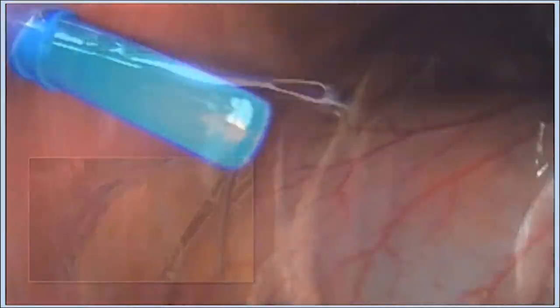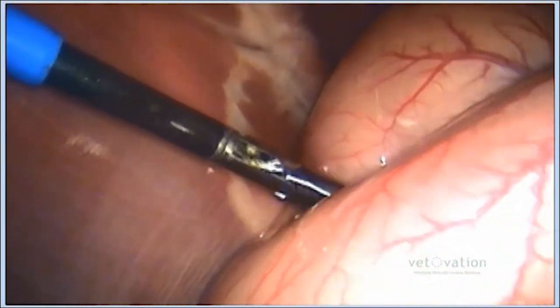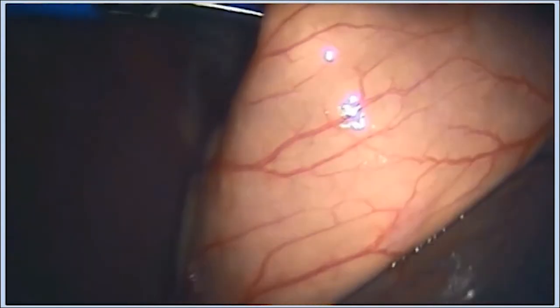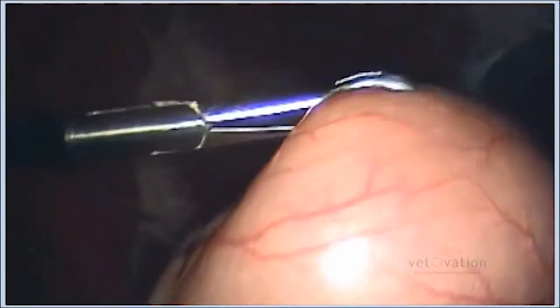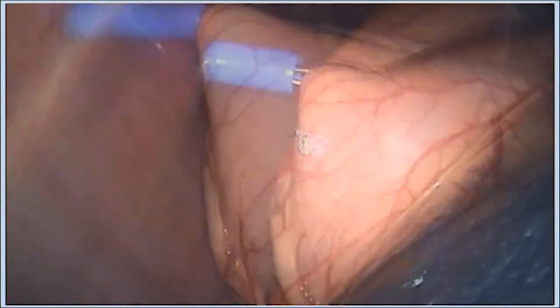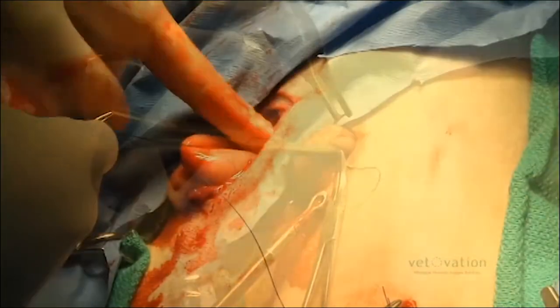At the time of a spay or neuter, many veterinarians will also perform a prophylactic gastropexy. A trocar is placed at the location of the pexy site. A 5mm Babcock grasper gently pulls the stomach to the abdominal wall. Stay sutures are placed to hold the stomach.